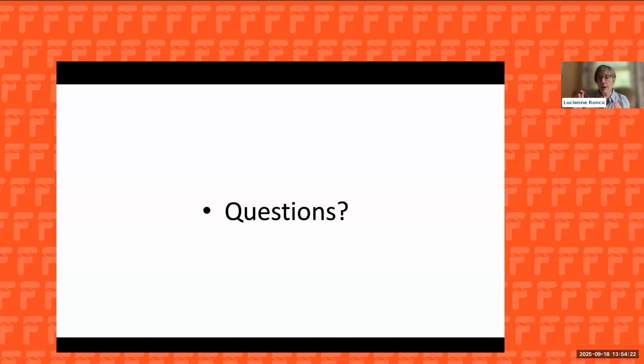And I'm going to take him to a later stage question here, which I think is also important, and I'd like people to understand. We believe, Seth for sure believes, I believe, I think the community believes, that MRI is going to be valuable for selecting patients who might progress during the time course of a clinical trial. Using MRI could make us more successful in running our clinical trials because we'll have identified muscles or muscle groups that are likely to progress. Then we can measure that progression when they're getting no drug versus when they are getting a drug. So, Seth, I'll ask you to reiterate that point that you made and exemplify it a bit more.